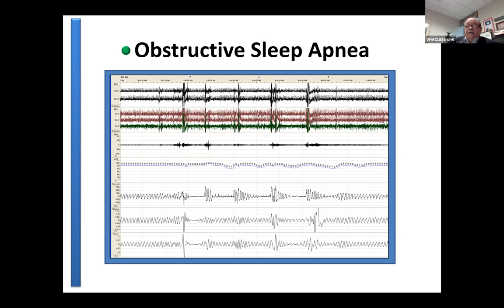And then look at the response to that one. It's an over response. What's that called? Well, let's go through it again. You've got that, and then it happens again. It goes down, it goes up again, and then it goes down. Then it goes up again. Then it goes down, then it goes up again, and then it comes down. But then it evens out. So what is that? High loop gain. That's what loop gain is.